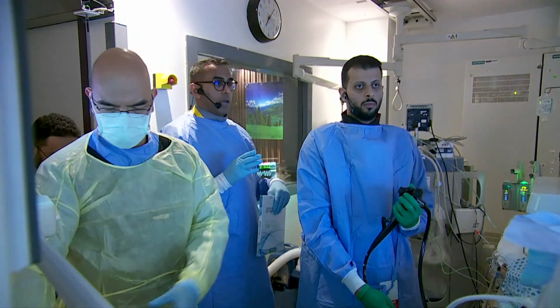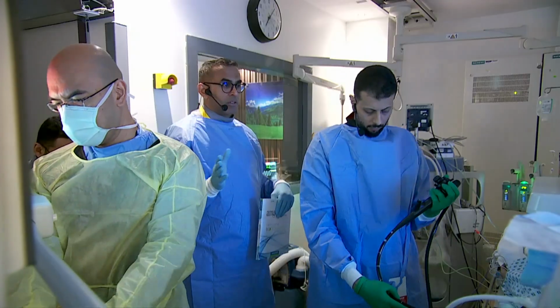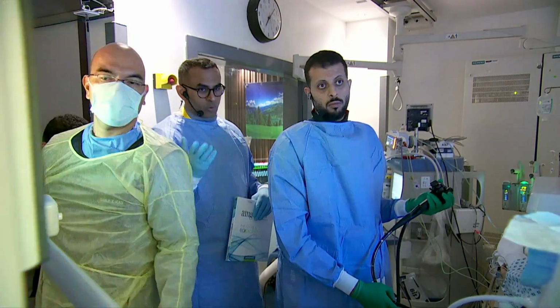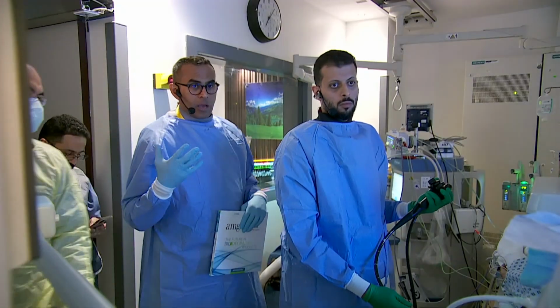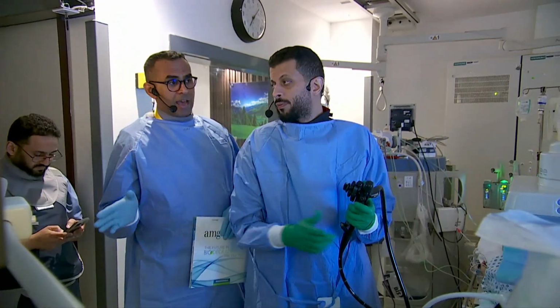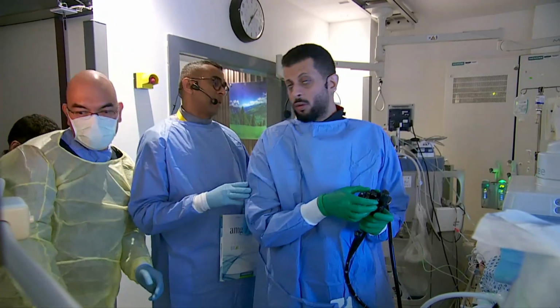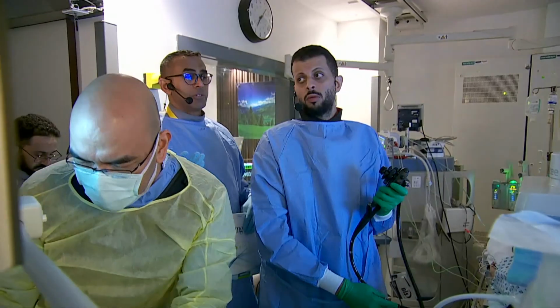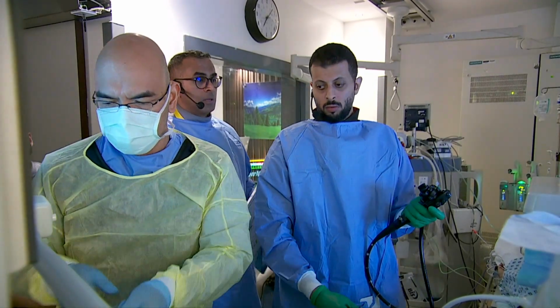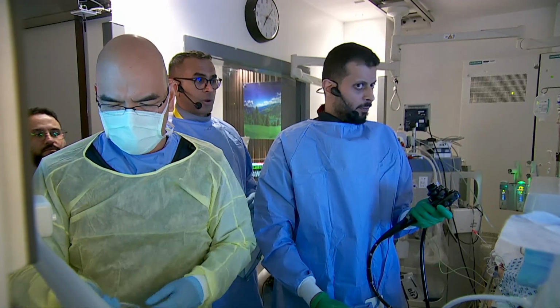So, available in the market, we have 3 types of stents from Archimedes. We have, of course, the pancreatic, and we have the biliary. They have the slow biodegradable, the intermediate, and the fast. The fast can dissolve completely in a matter of 10 days. The intermediate can last for 3 weeks, and the slow type can last for about 3 months.